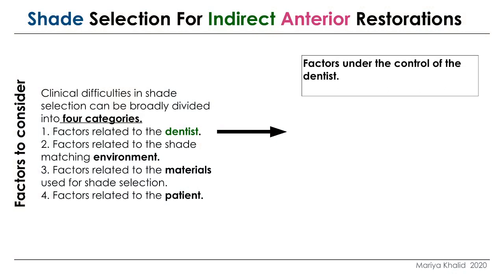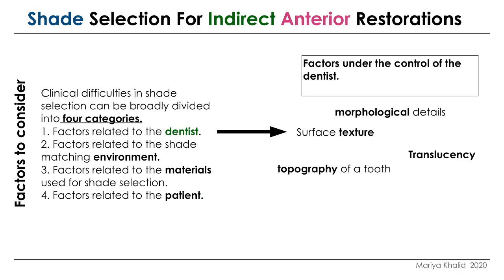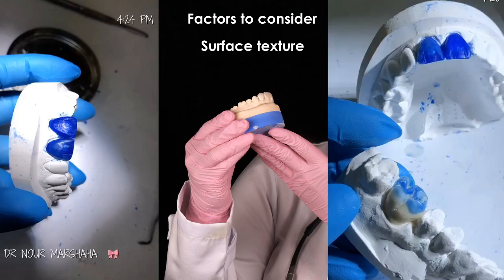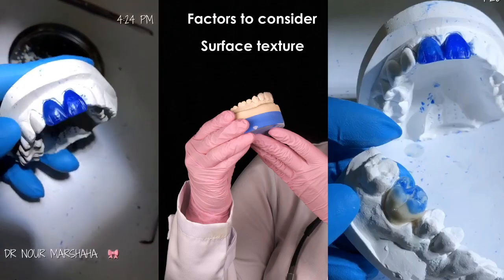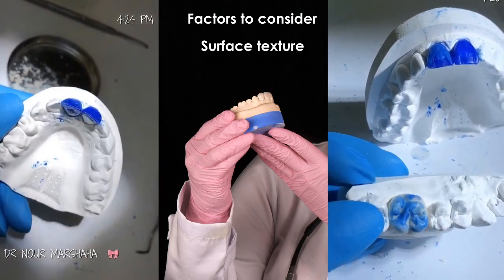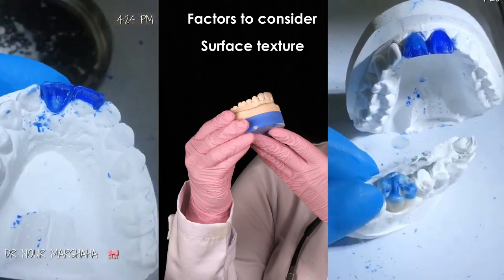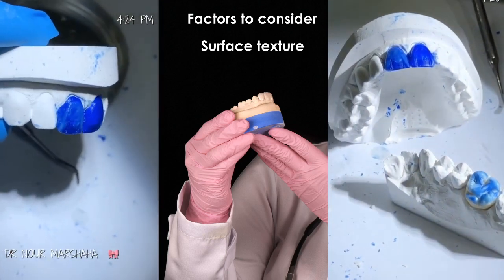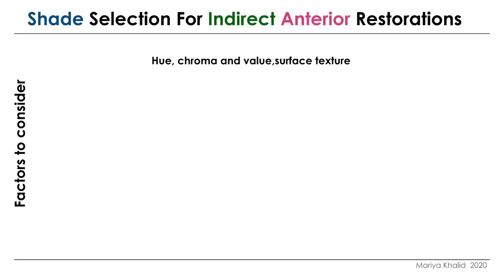Factors under control of the dentist: morphological details and surface texture, translucency, topography of the tooth, and stump shade. All of these should be recorded and understood before communicating with the dental lab. You have to know how to do carving, how to do a wax-up, and you have to know how to check the details when you receive the case from the dental lab before trying it on the patient.